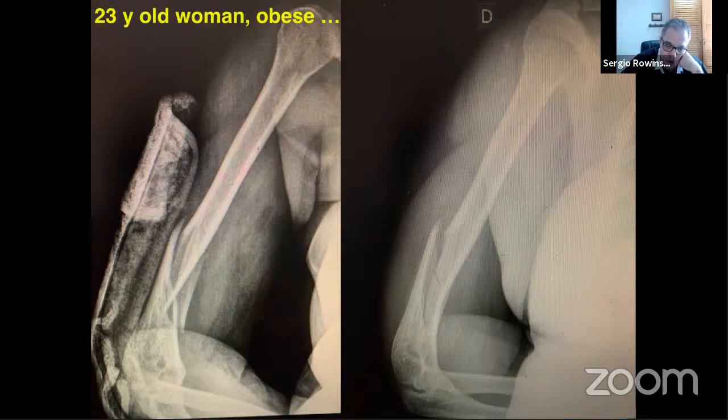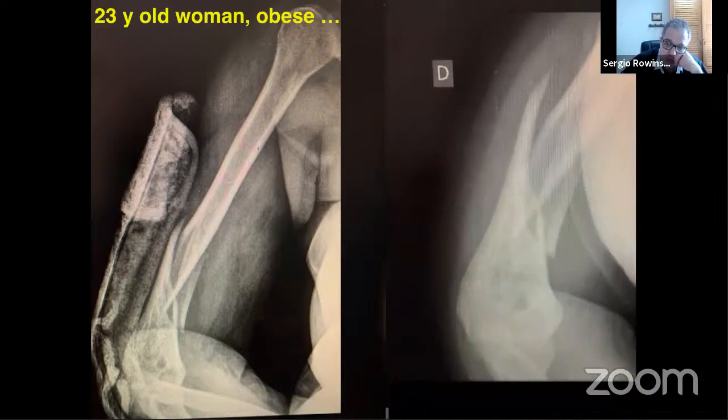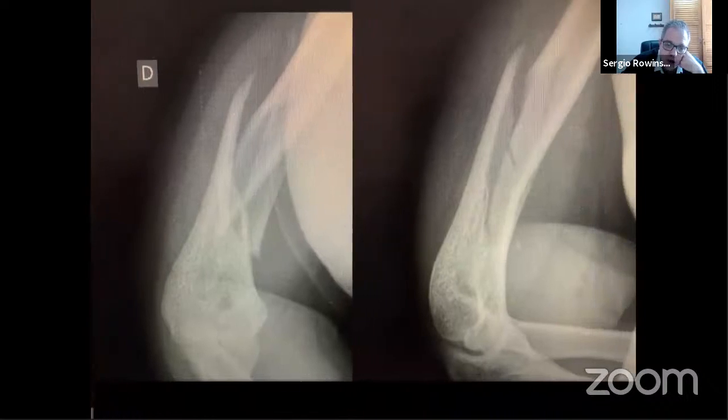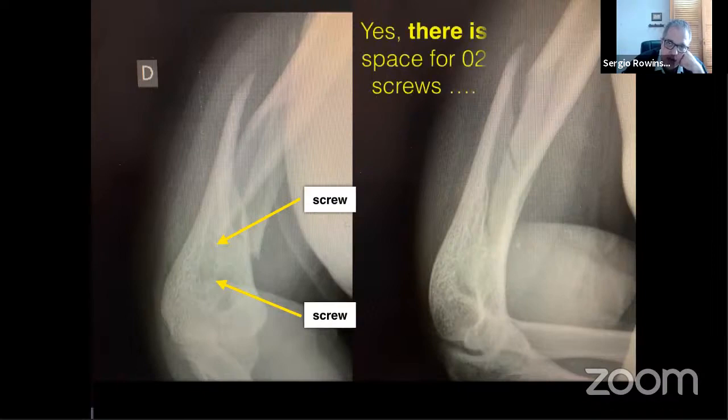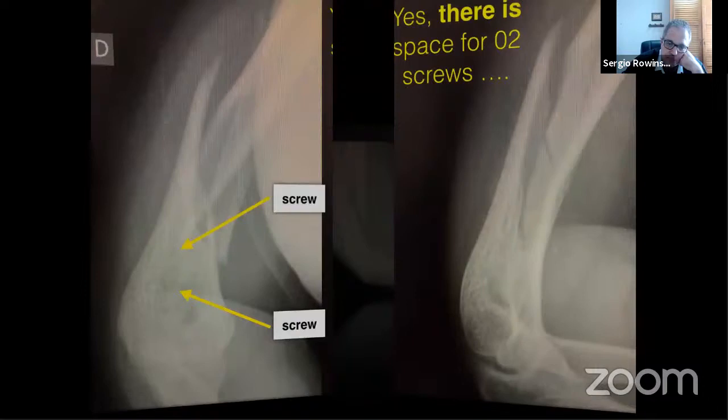She was quite obese. So my question has always been this: can I put 2 screws down? Well, I can put 1 screw here, and I can put another screw here. So the question I have to ask is, can I put 2 screws? If the answer is yes, I can do the job.